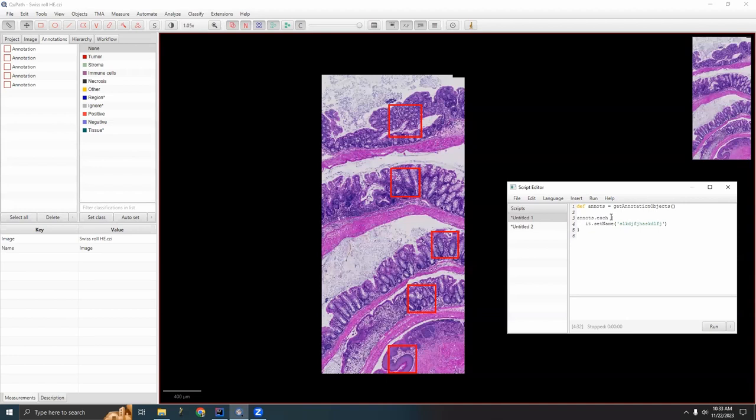And for that, we actually need to bring back in the index variable that this .each so neatly hides. And so I'm going to change from .each to .eachWithIndex. And this way, Groovy will give you both the object within the list you're looping over and the counter. But once you have the with index, you actually can't use it anymore. You need to specify what you're going to call each annotation. And in this case, we're going to call it annot. And we're also going to call the indexing variable idx.